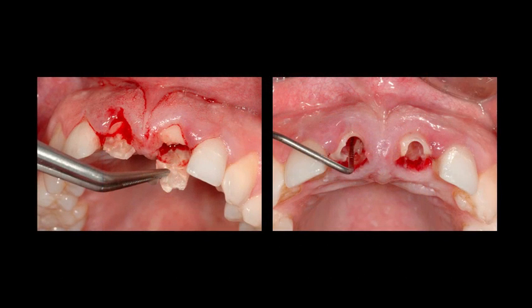The main concern when we're doing two implants next to one another in the aesthetic zone is the tissue between the two implants. It's very hard to get a papilla or achieve a final papilla around a case like that. So I explained this to the patient. I told him we do everything we can to achieve a good result, but it's a difficult case to get a good result. So he understood that the expectations needed to be lowered a little bit.